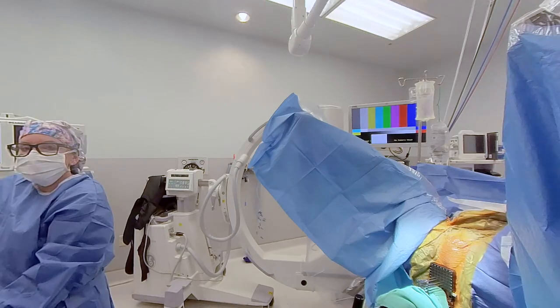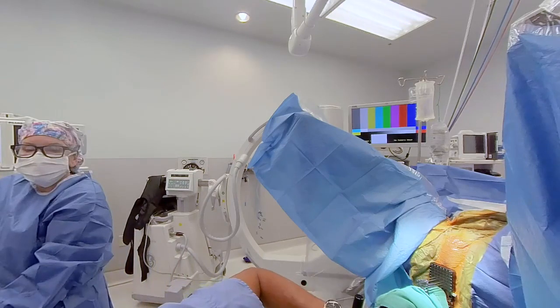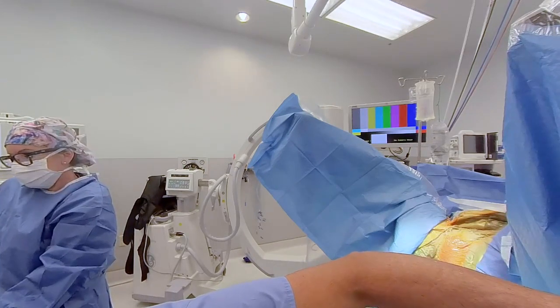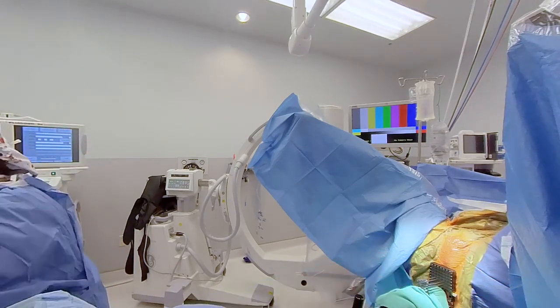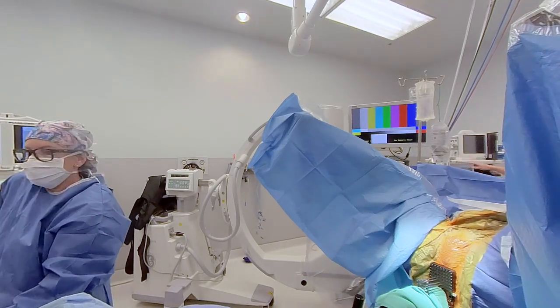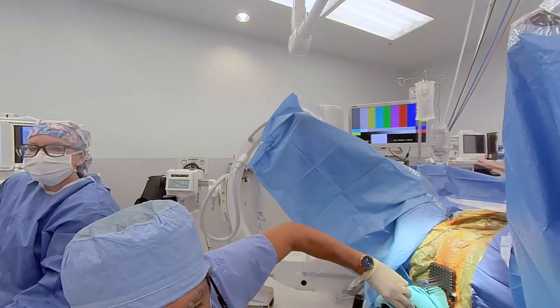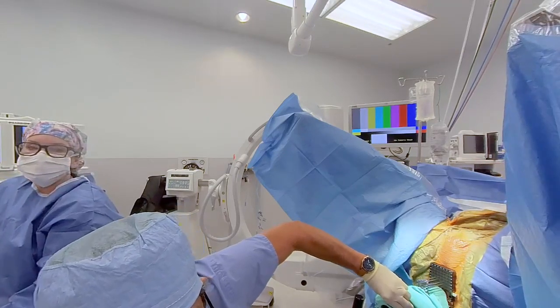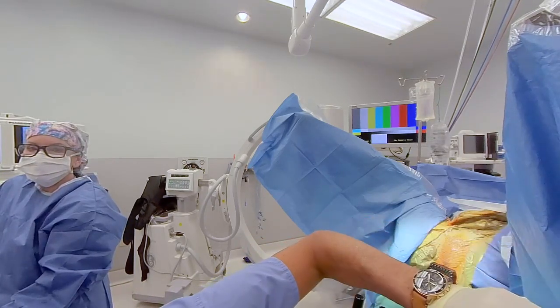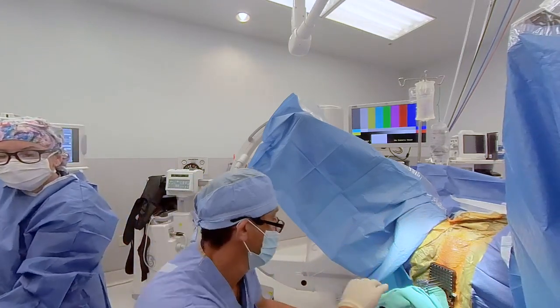This one, I think it's okay. I think you're almost spot on here. Now I would just move the urethra, move the whole thing down. Yep. Now here's the position of the urethra, right there. So if you just move the whole thing down like 1 millimeter, right there. That's perfect. You're dead on. Okay. Brilliant. Okay, let's do the plan.